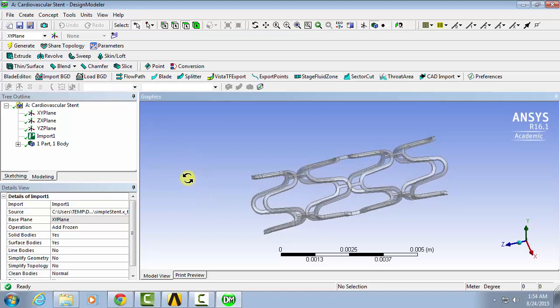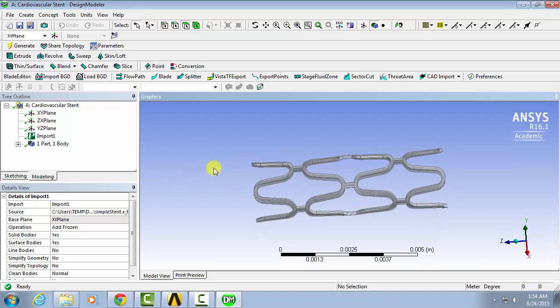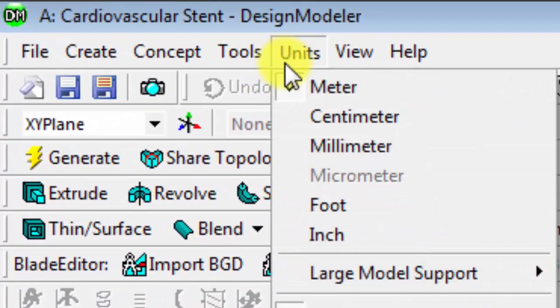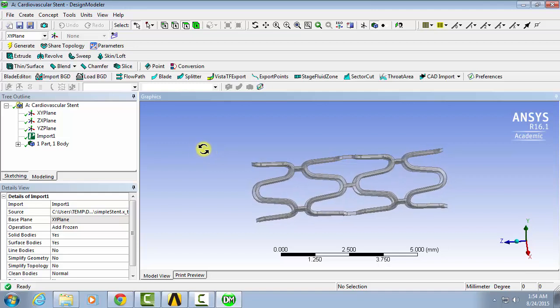Now from here, what we want to do is add the balloon into the center of the stent, and we also want to cut the stent up into symmetric pieces. That way we can simplify the model and reduce calculation time. So first we're going to go to Units and select millimeter, and then we're going to start cutting up the stent into symmetric pieces.